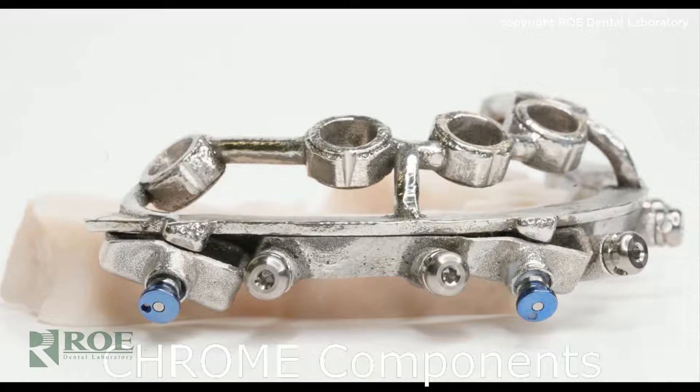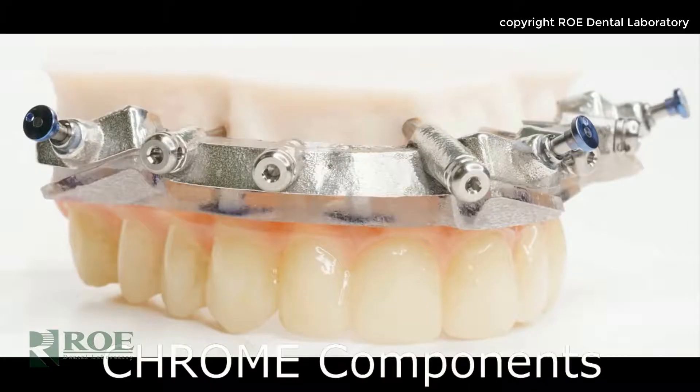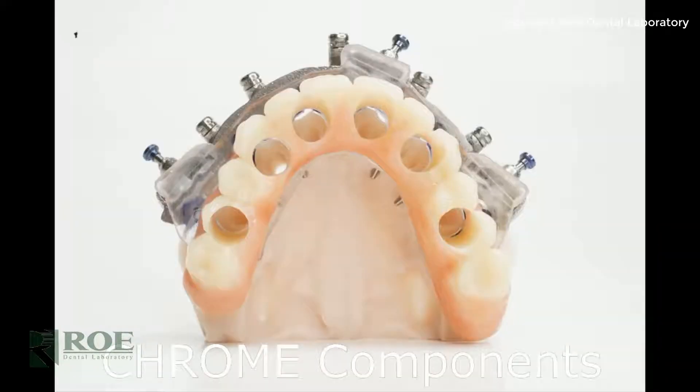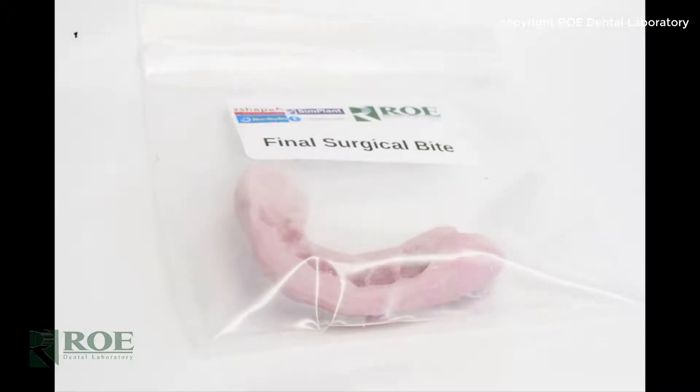The carrier guide supports the prosthetic as well as the rapid appliance. It also aligns the multi-unit abutments and gives direction for the implant rotation. And then finally there is the surgical bite to ensure the upper and lower come together.